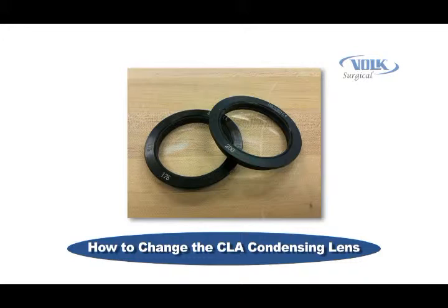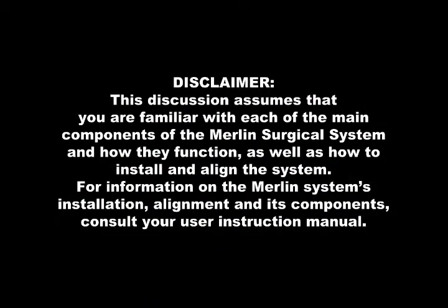The only tool required is a 0.050 inch hex wrench. This discussion assumes that you are familiar with each of the main components of the Merlin Surgical System and how they function, as well as how to install and align the system. For information on the Merlin System's installation, alignment, and its components, consult your user instruction manual.